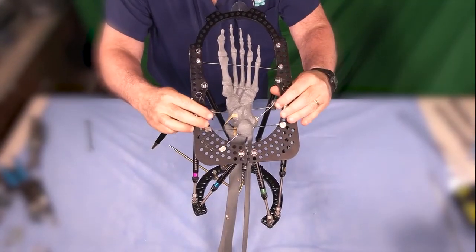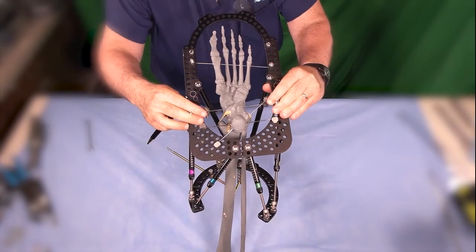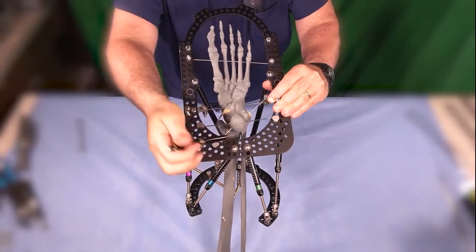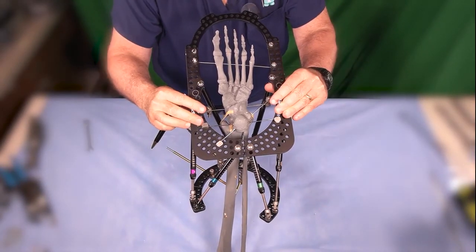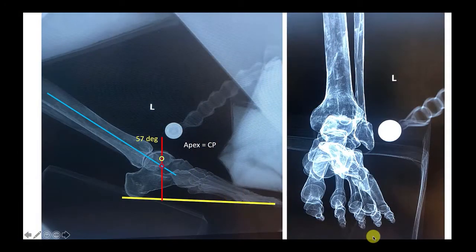On the AP view, our center of the ring is lined up with the center of the heel and the 3rd toe. So we have essentially no offsets for our mounting parameters on the AP view. We've completed the frame application and now we have to run the program. First, let's take a look at our preoperative x-rays.